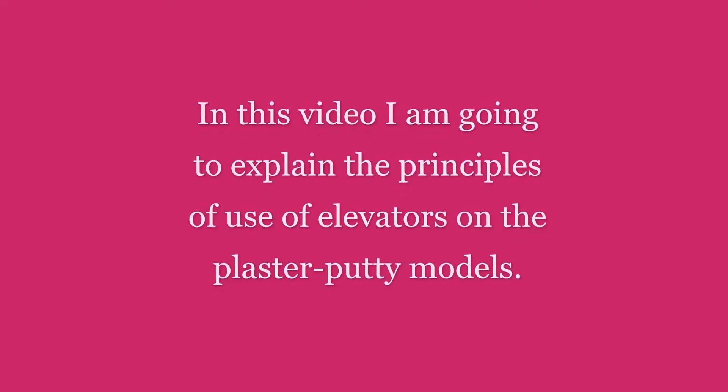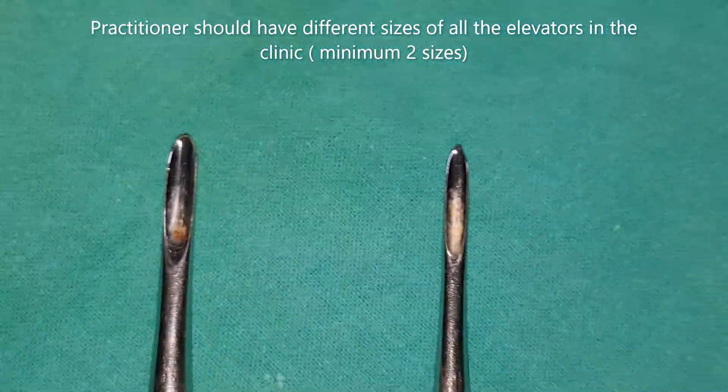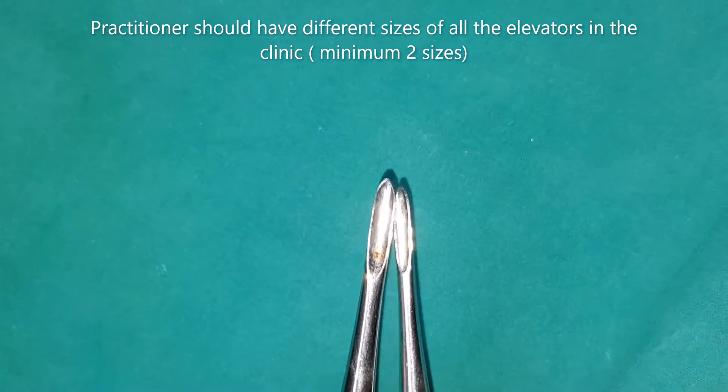In this video, I am going to explain the principles of use of elevators on the plaster/putty models. First of all, we should have two sizes of straight elevators — or any elevators — in our clinic. A minimum of two sizes of elevators are recommended: a smaller one and then a bigger one.